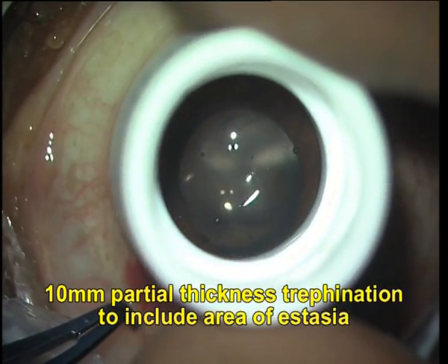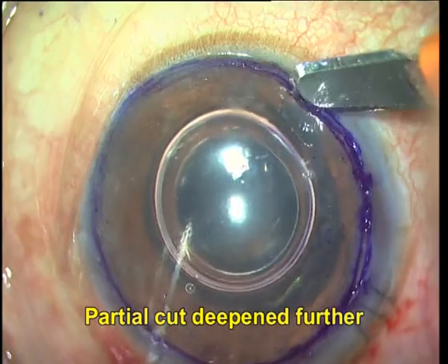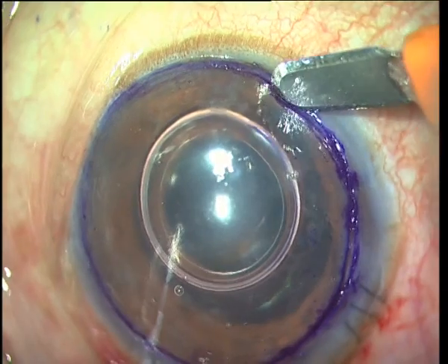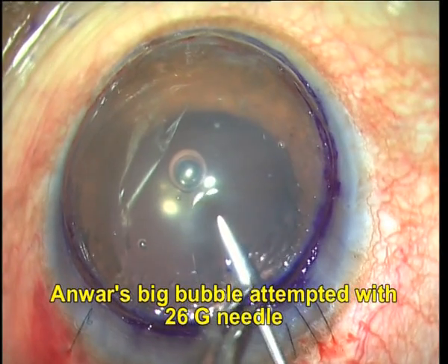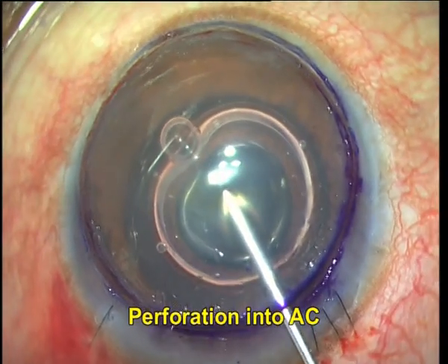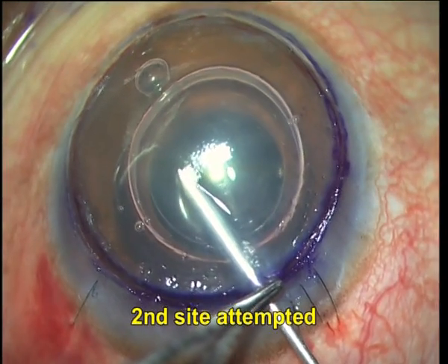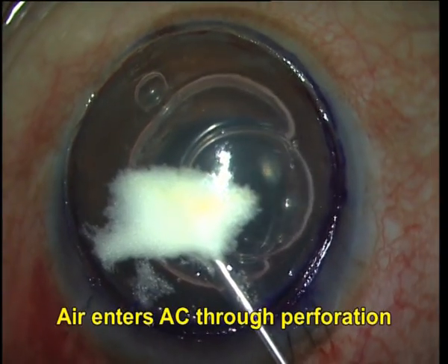A 10 mm partial thickness trephination is then done to include the area of ectasia, and I now deepen the partial cut further so as to get a groove all around the trephine. I am now attempting to create an inverse big bubble, but as you can see, my needle has perforated through the endothelium and the bubble instead enters the anterior chamber.